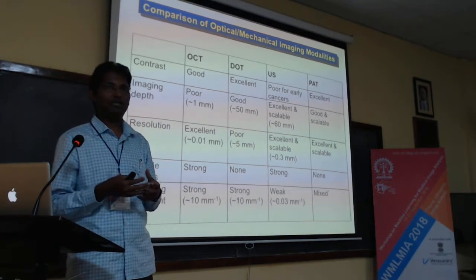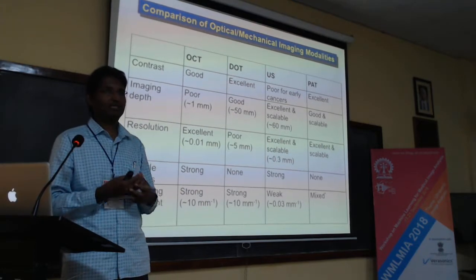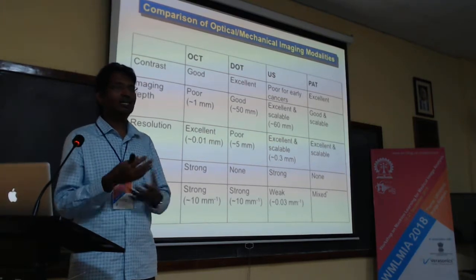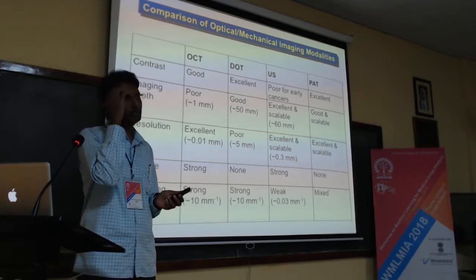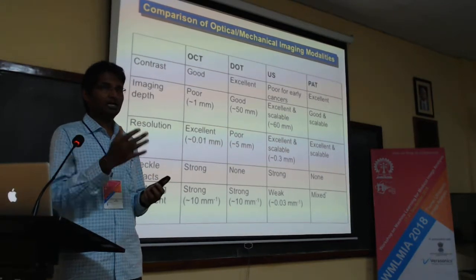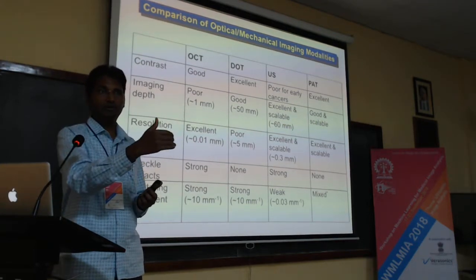Because it becomes operator dependent, and of course it's a complicated technology as such. You are talking about a lot of interactions and trying to capture an image. You are also talking about contrast hidden in the spectrum, and the reading of those images is also not straightforward. Of course, there are multiple applications which have adapted very well. For example, in cardiac imaging, echo has been the standard way. So there are multiple of them which have really translated to a very high clinical level.